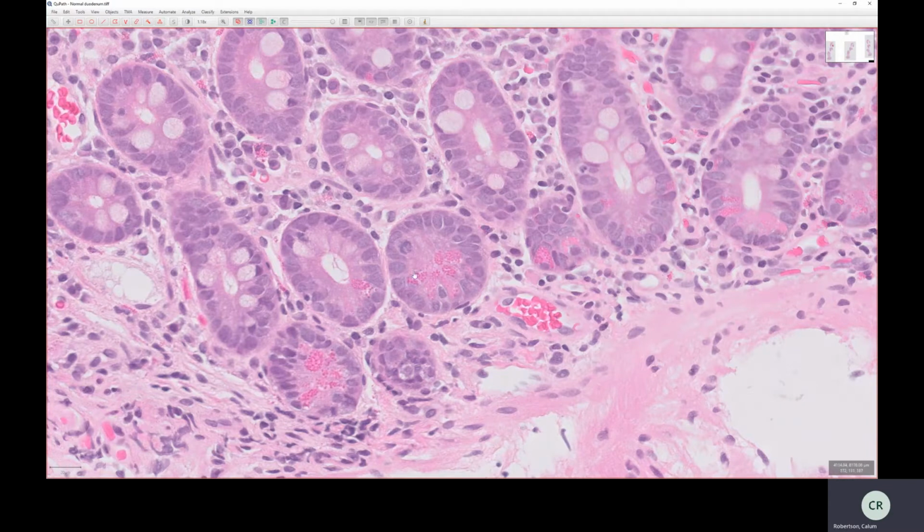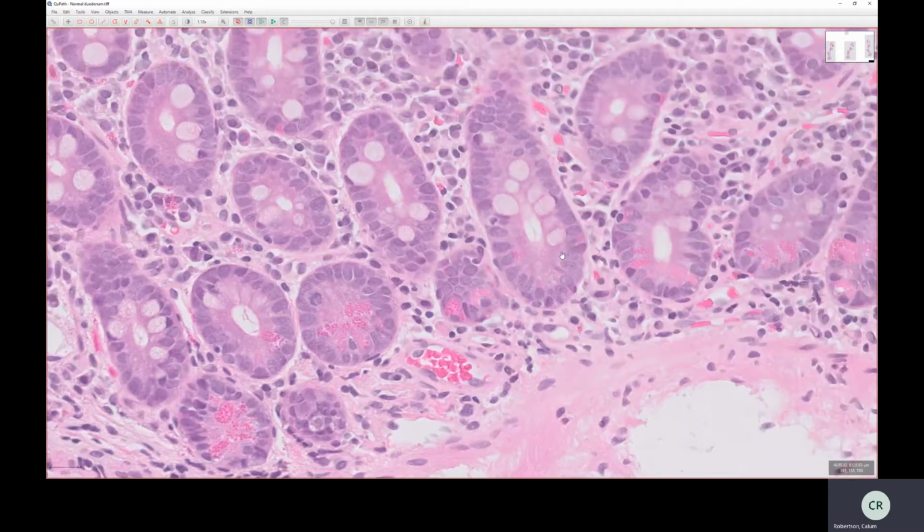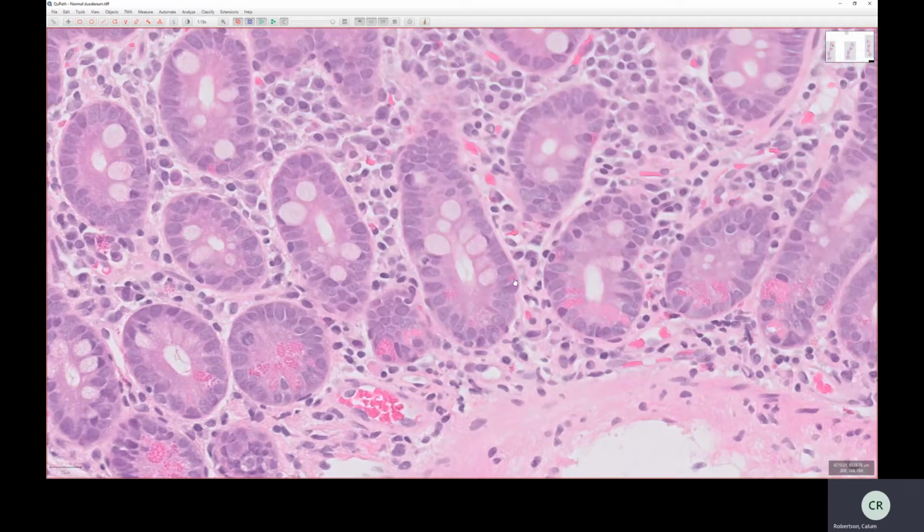There's quite a lot of them here, actually. All of these are Paneth cells, more Paneth cell, more Paneth cell. This one is different though. Although it looks almost identical, it's just flipped the other way around. So the nucleus is at the top, and underneath that are the secretory granules. So this is a neuroendocrine cell.